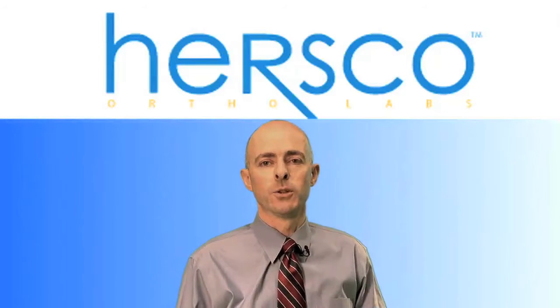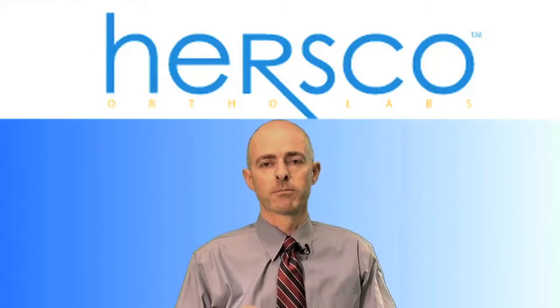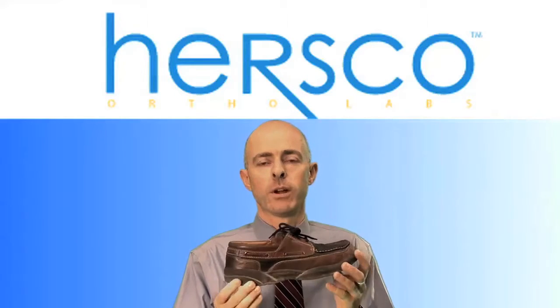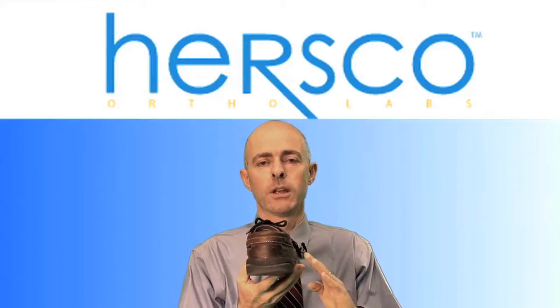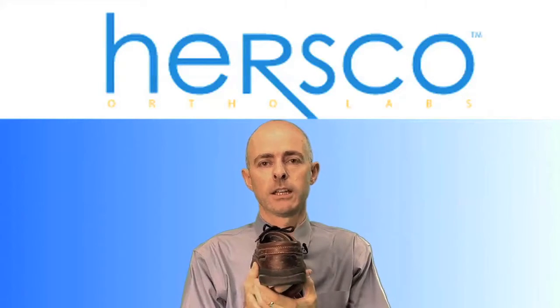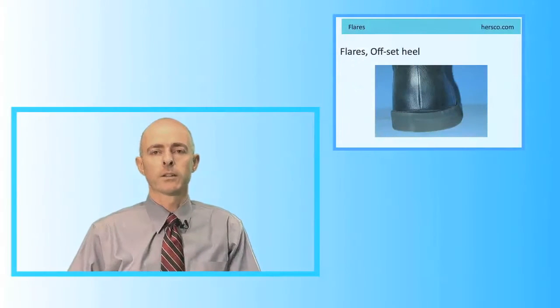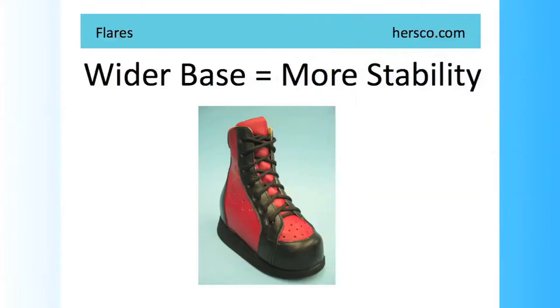Adding flares to a shoe gives it a wider base and makes the shoe more stable. So you can take a regular retail shoe and then add material to either side of the midsole, extending it out medially and laterally. This has the effect of making the shoe more stable for the patient and will also help them if they tend to invert or evert. Providing a wider base of gait will prevent that rotation and give them the stability that they desire.